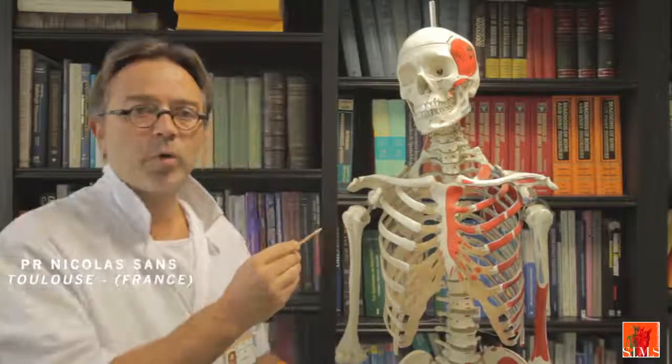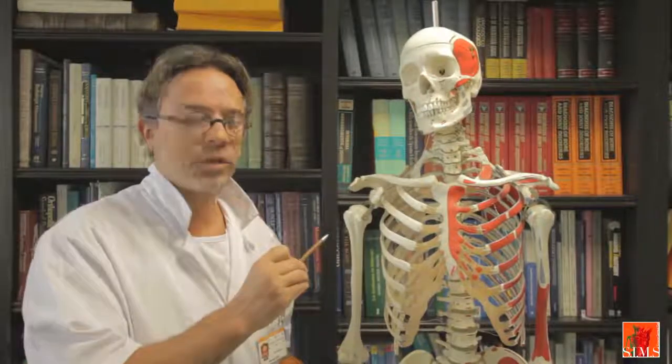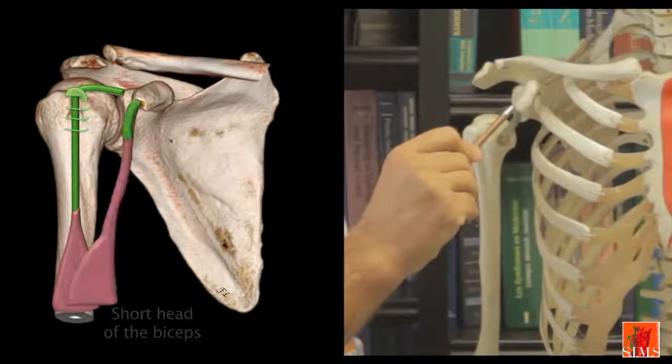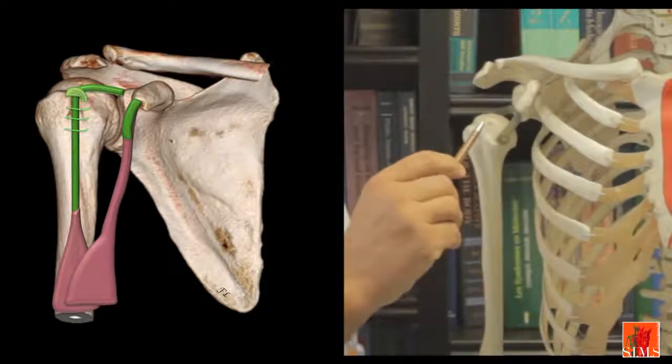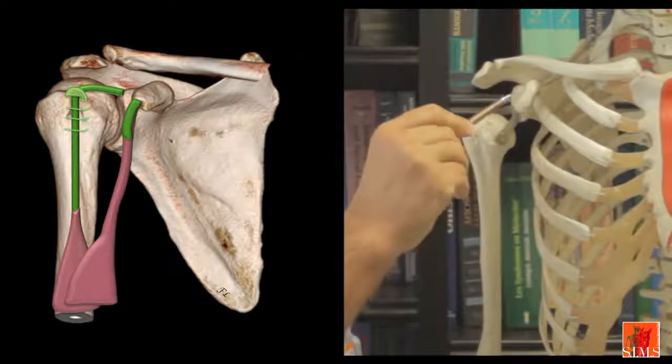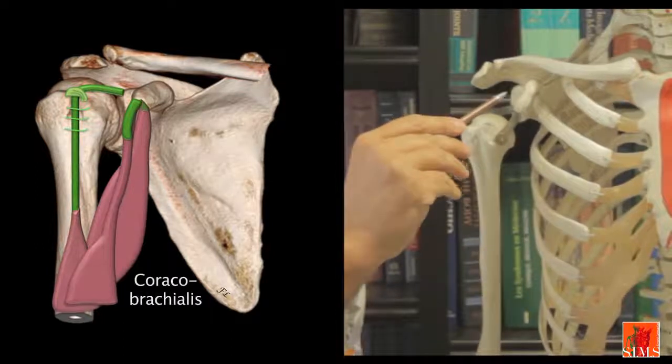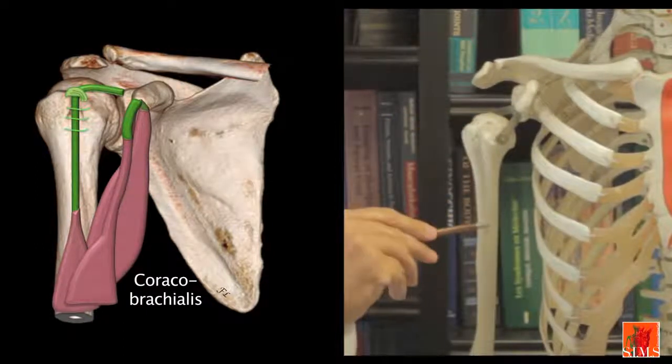The coracoid process is the seat of 3 tendinous insertions, the most lateral of which is that of the short biceps muscle, which will merge with the long portion of the biceps. Above that insertion, you will find the tendinous insertion of the coracobrachialis muscle, which will insert on the medial part of the diaphysis of the humerus.